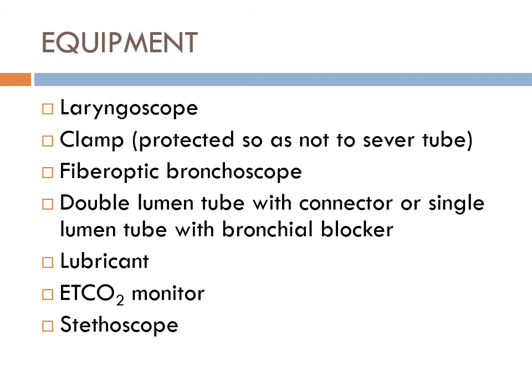The air is going to go past this blue cuff that's not inflated, and it's going to ventilate the left lung, right? And then when the patient exhales, it's going to go the opposite way. It's going to go back into the single lumen tube. But we need to let air out of this lung because it's inflated. So you're going to leave the yellow side port open. You're going to cap the blue side, okay?